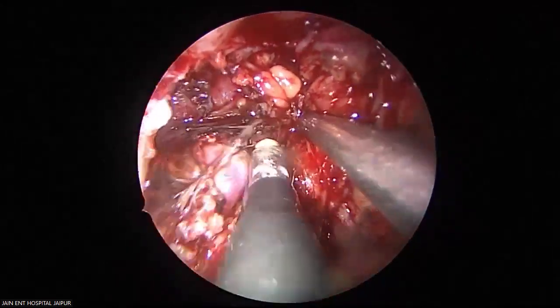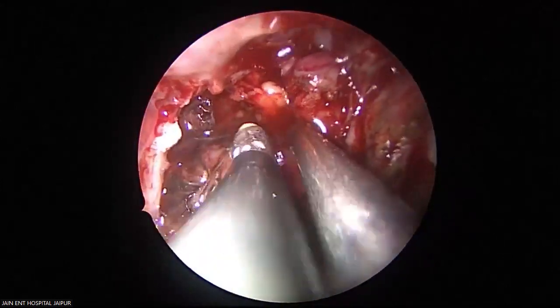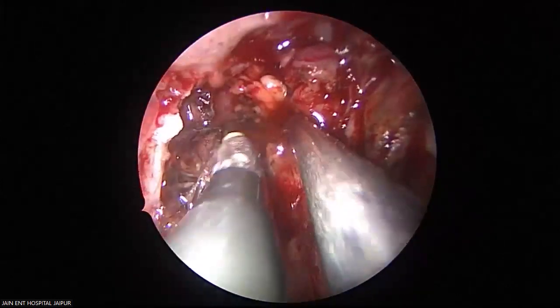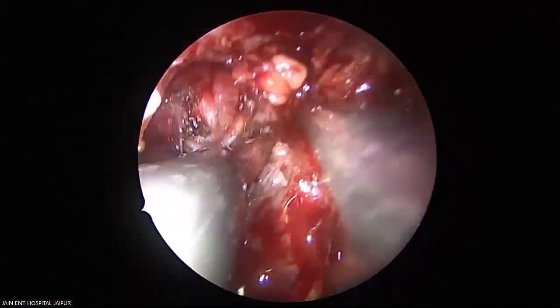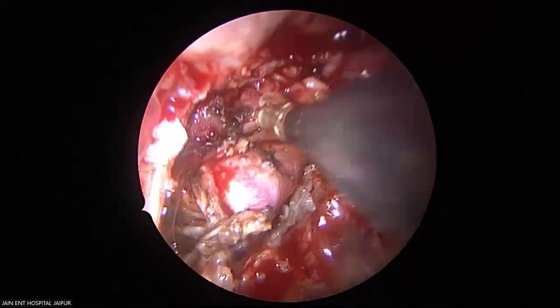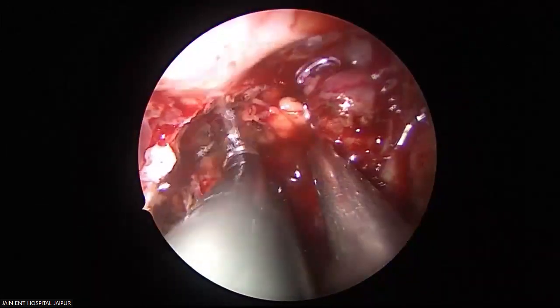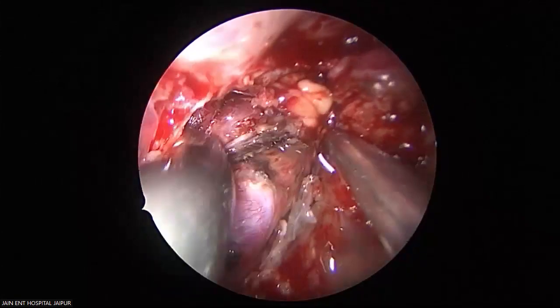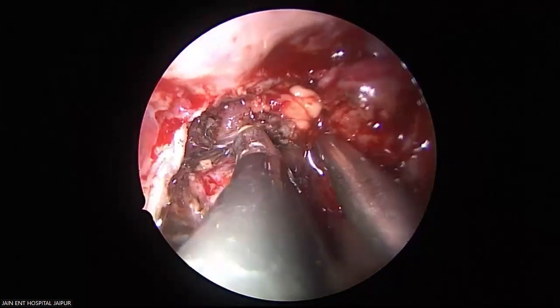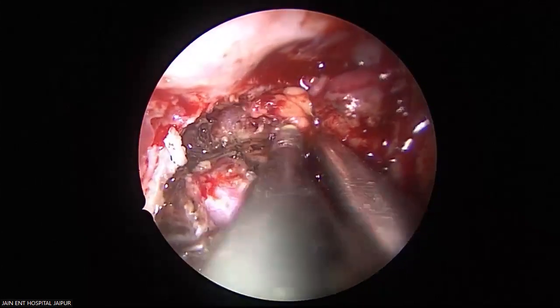Many of the tumor branches, see, one more I am coagulating here and cutting at the same time. The more you cut, the more you release the exposure. Can you see? Most of the part is out, I mean exposed. And you always say exposure is the key.